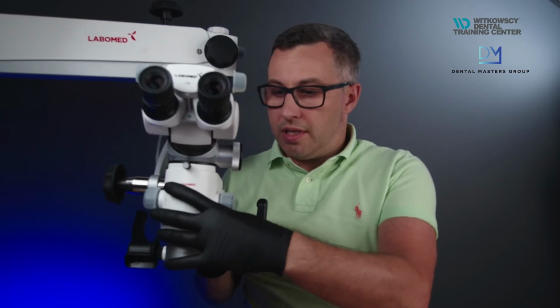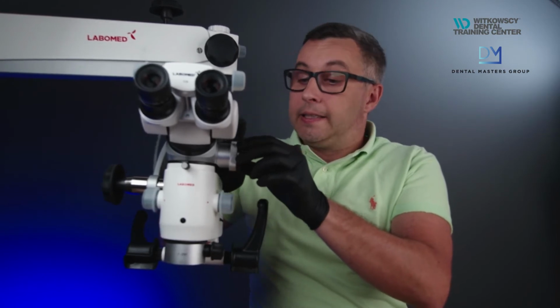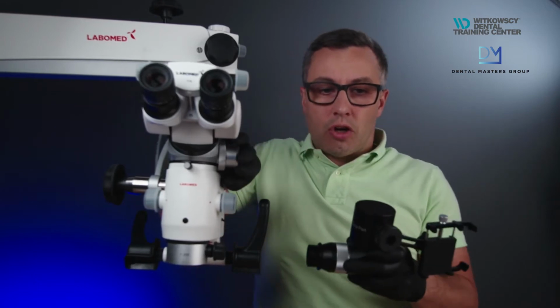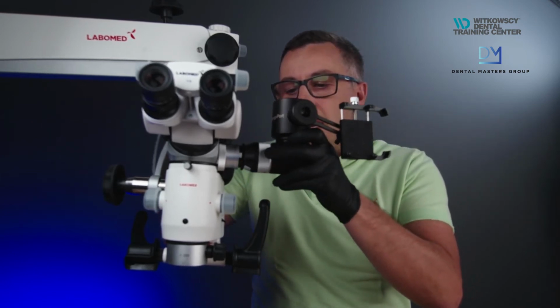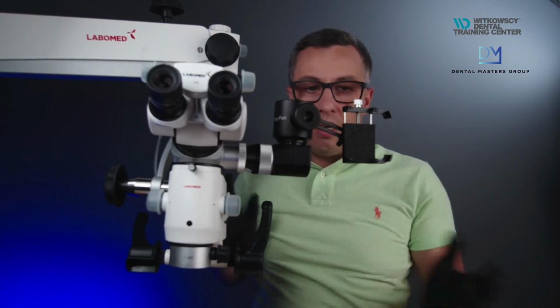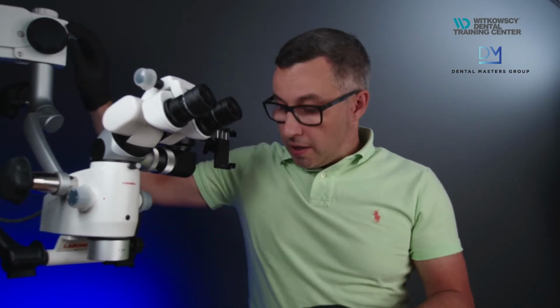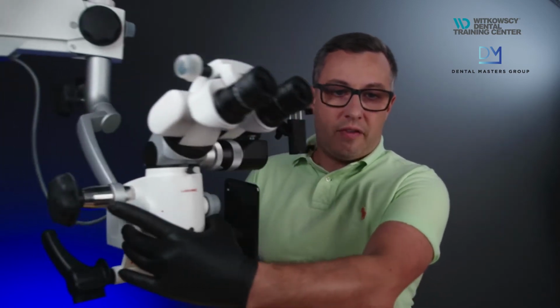Now, this is the fun part. Sorry, something with my throat today. You unscrew these. Be very careful, because with the optics, you need to cover everything in order not to let any dust inside. So it's better not to unscrew it a lot. Just do it once and that's it. And then you put it inside the socket and you turn it in. And that's it. And now you can use this adapter for viewing. So let's see what we can see and how we can see with this adapter. So I will connect the phone right now.